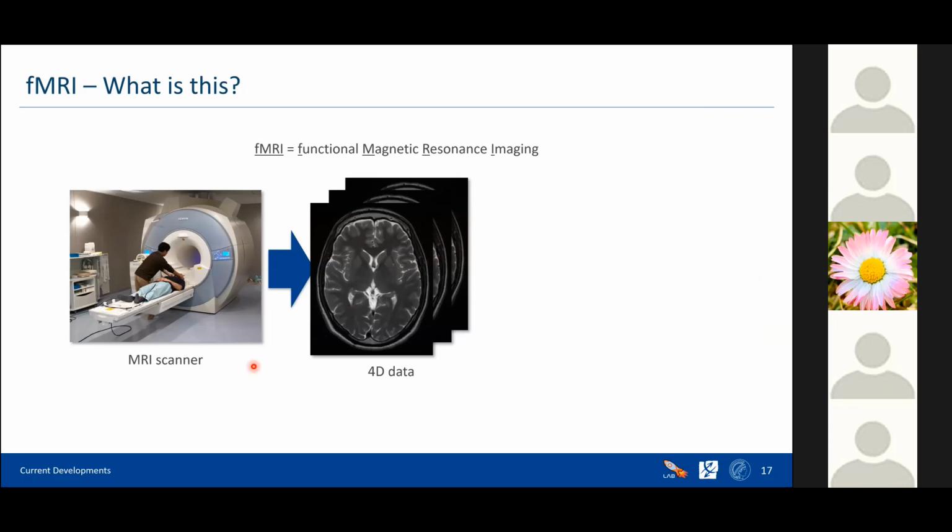And how we do that is that we analyze this time series of 3-dimensional data, whether it correlates with some kind of event which we presented to the person lying in the scanner. So for example, if we present the person some kind of a cat video, does something change inside the brain correlating to the time point where we presented this cat video?